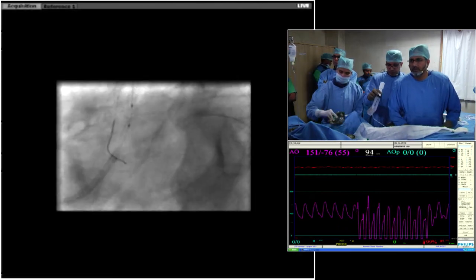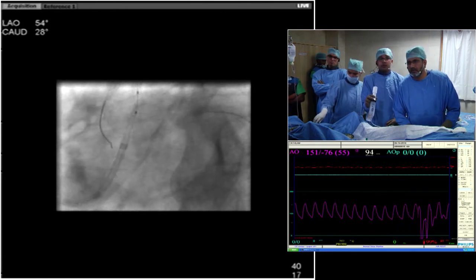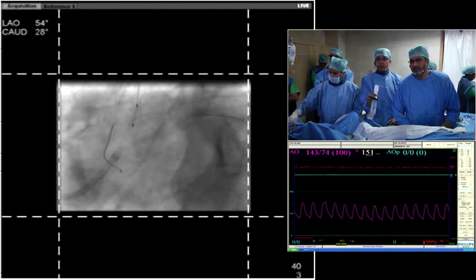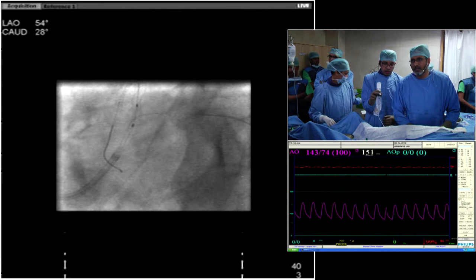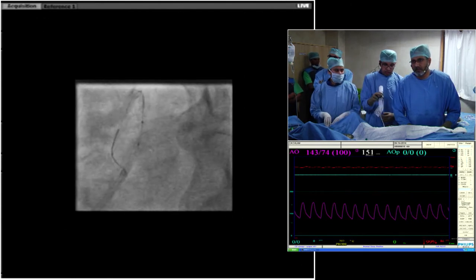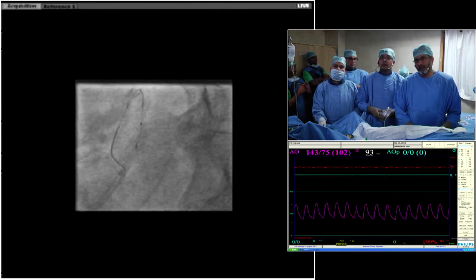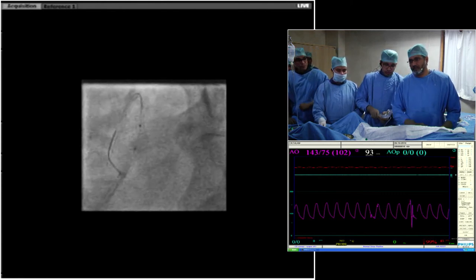Stent boost, please. As you're finishing up here in the left main LAD system, are you planning on doing the right coronary at the same sitting? The right coronary has already been done 48 hours back. I finished the right coronary and the left circumflex, and at the same time, I did the OCT for the LAD, and that is when we thought that we'll go ahead with this case for the live demonstration. Yeah, please go ahead.